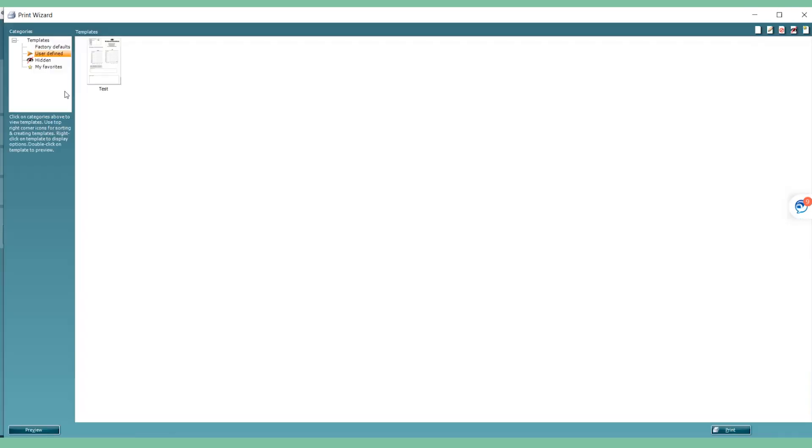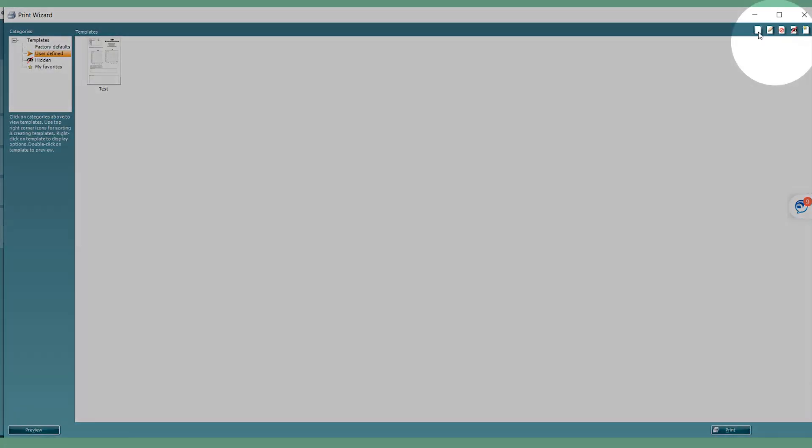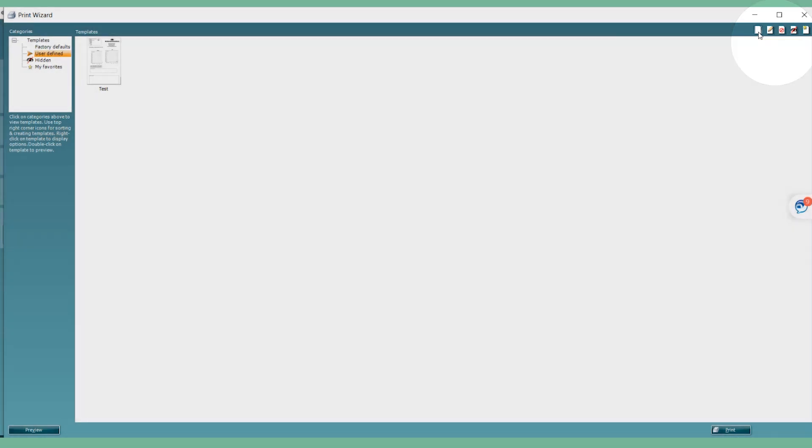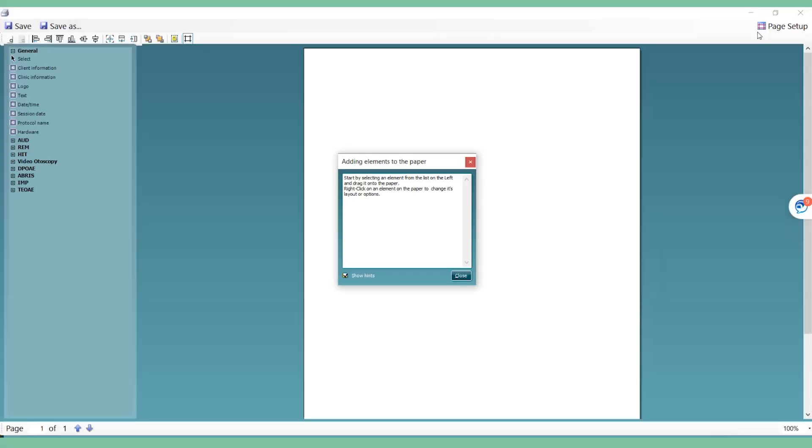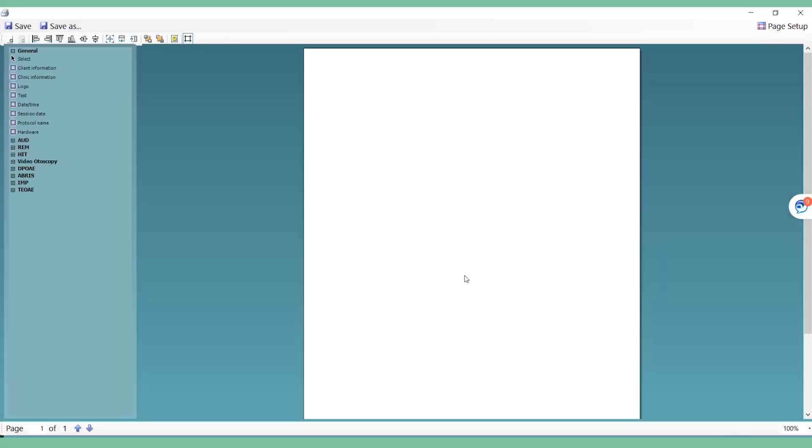If you wish to create a new template from the beginning, simply click on New in the top right-hand corner and create your print layout as desired. Now that you have created your required print layouts, you can test your patient and then print.